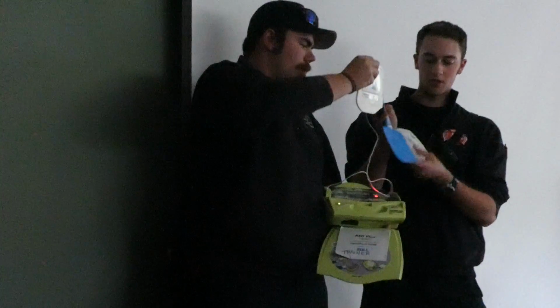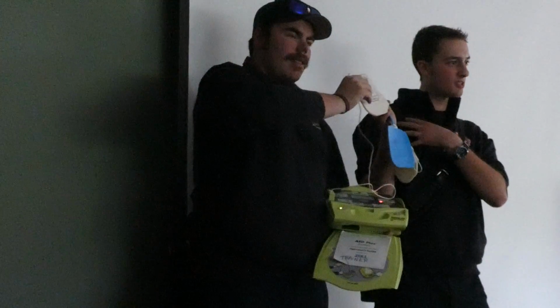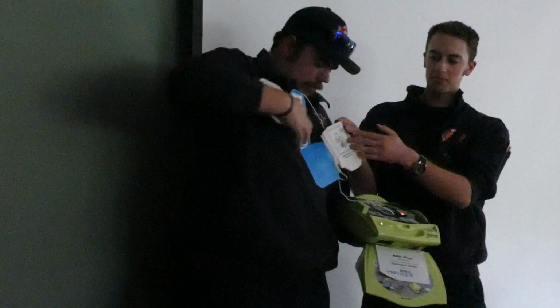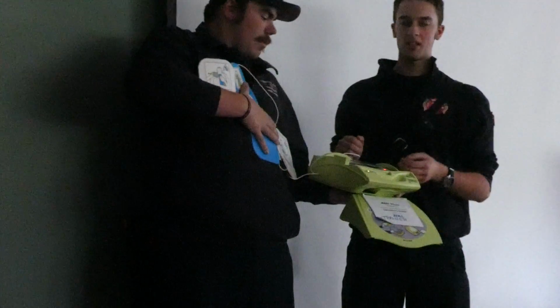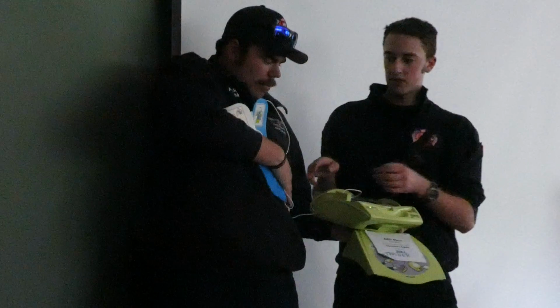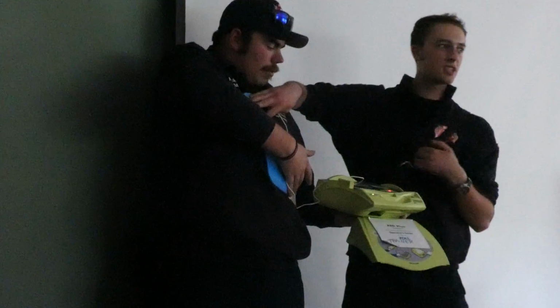It comes with pads inside, and there's a pad that goes up here on the top right of the patient's chest, and then this pad down on the lower left of the chest. There's this little sticky thing, so you just pull it back off, and it's got to be on their bare chest, so you have to take their shirt off. Stick it there, and you want this little red cross right in the middle of the patient's chest. Don't touch patient. Analyzing.